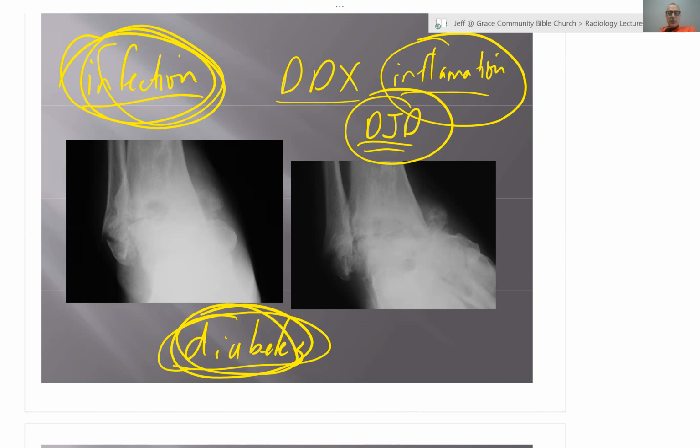On a side note, just of interest, apparently that's what happens with lepers, with the leprosy. Yes. They lose the nerve sensation and their tissue, everything just gets so traumatized. That's the visual injury you see, but it's not that the skin's actually falling off from bad skin, we could say. Exactly. And in fact, diabetic neuropathy and neuropathy from leprosy can look indistinguishable on plain film. I just didn't have it on my list because it's way more rare, but it would look the same. The mechanism is the same.